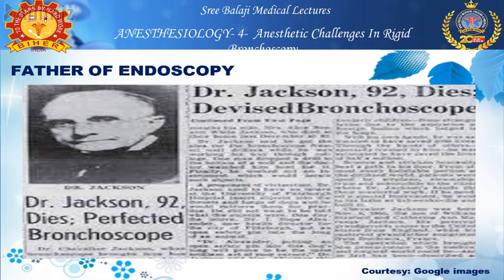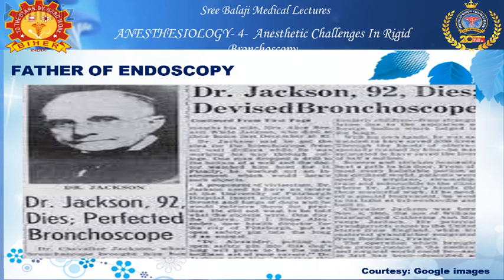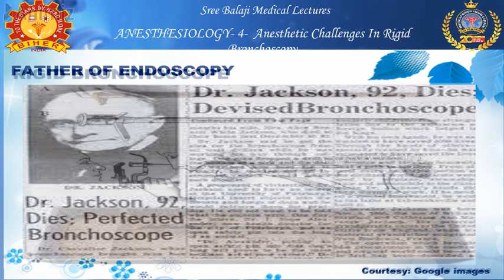Now let's have a look at the father of endoscopy. Dr. Chevalier Jackson was the first person to devise the rigid bronchoscope, and he has been using this device for more than 100 years. So Chevalier Jackson invented the bronchoscope, and the modern day bronchoscopes are nothing but a slight modification of his invention.